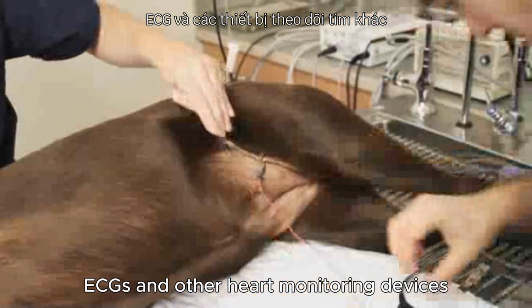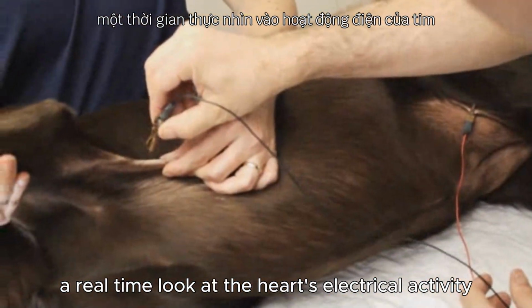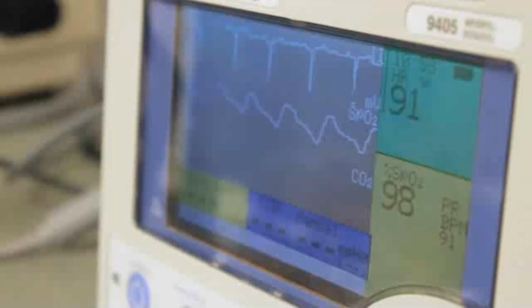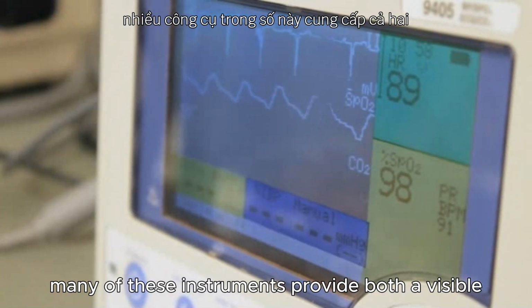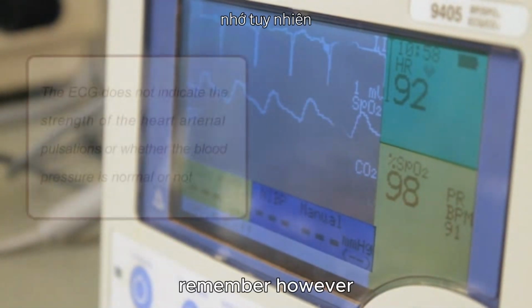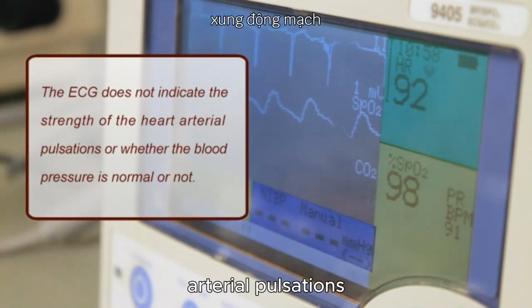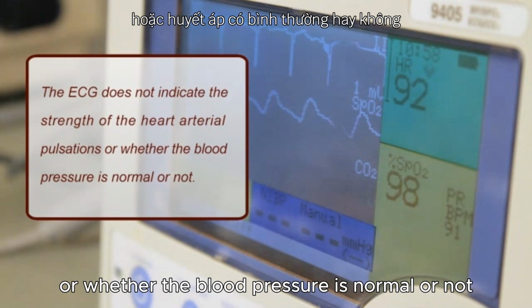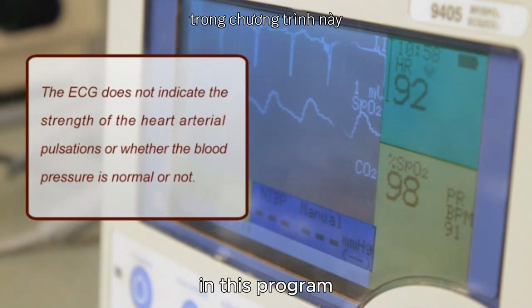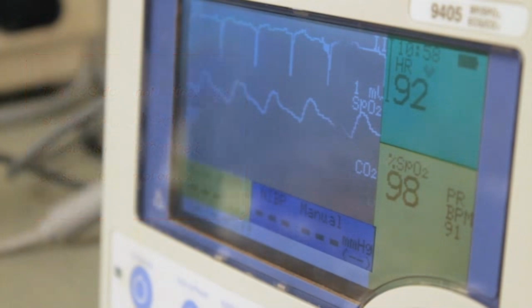ECGs and other heart monitoring devices all provide a real-time look at the heart's electrical activity, rate, and rhythm. Many of these instruments provide both a visible and an audible sound to indicate each beat of the heart. Remember, however, that the ECG does not indicate the strength of the heart arterial pulsations or whether the blood pressure is normal or not. In this program, we will not attempt to teach the science of interpreting the ECG waves.